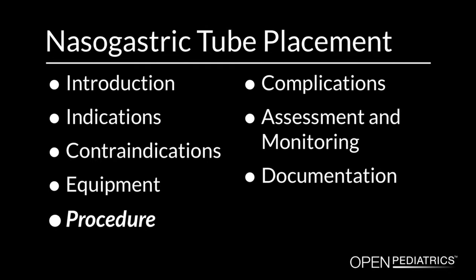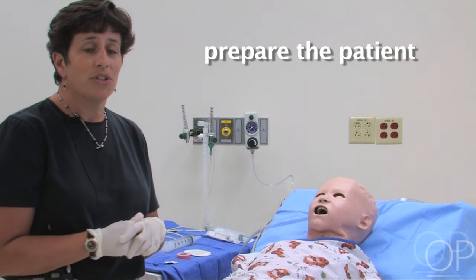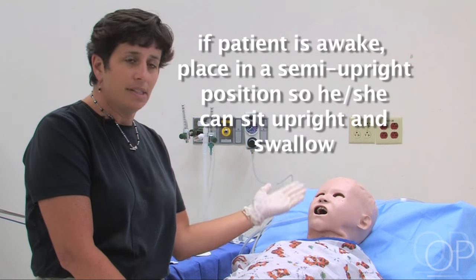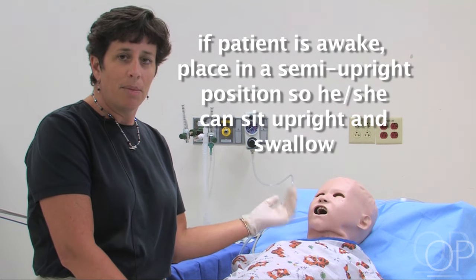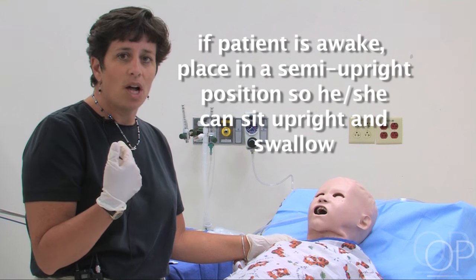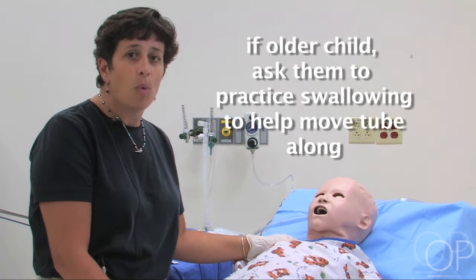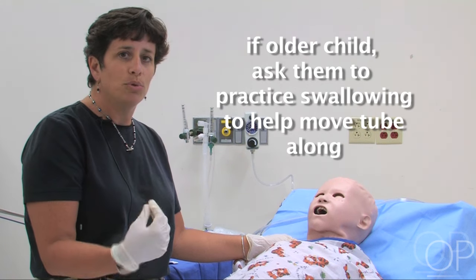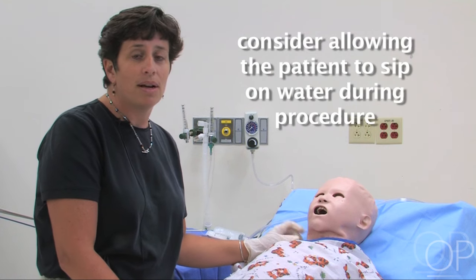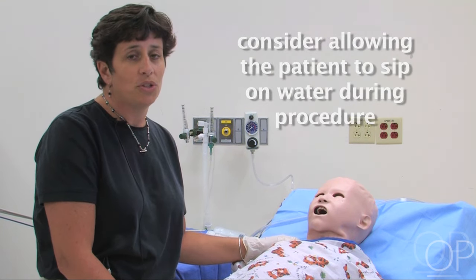Procedure. I'm going to get ready to prepare this patient for the tube placement now. If your patient is awake, the best position is in a semi-Fowler's or semi-upright position so that the patient can sit up and swallow. If you have a child who's old enough to help you, you can ask them to practice swallowing a few times because that will help move the tube along. If they're allowed to drink, you could have them sip on water with a straw while you put the tube in.